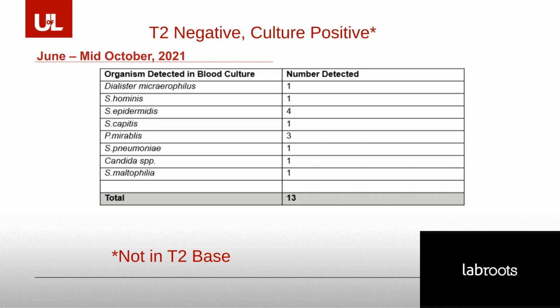And just like the T2 result that I shared with you a few moments ago with the Candida parapsilosis, that immediately initiated targeted therapy for that particular patient. So we will follow up and see how it came out.